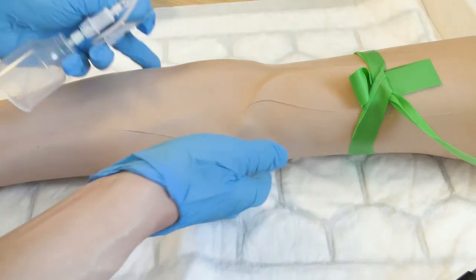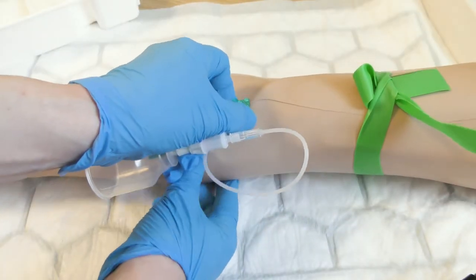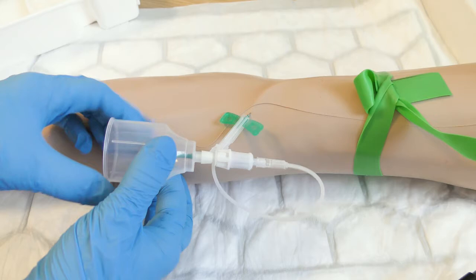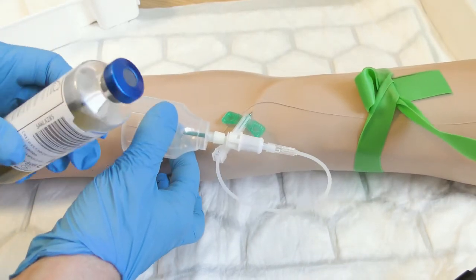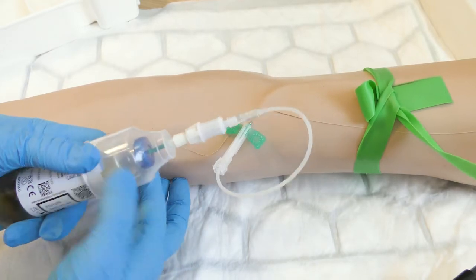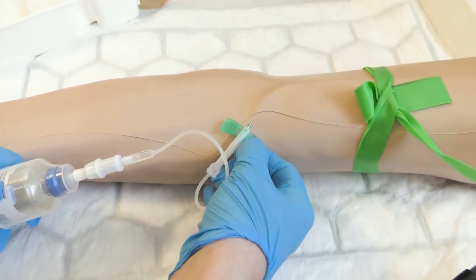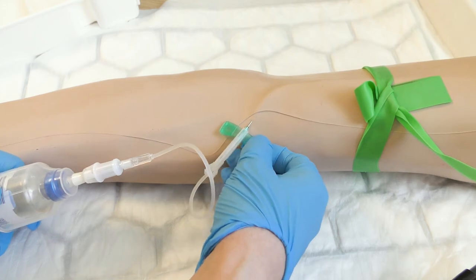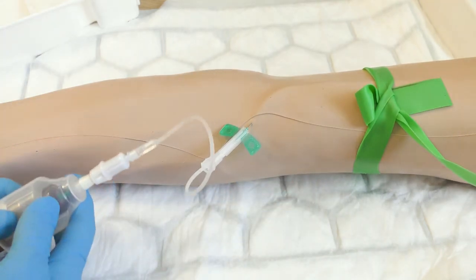Remove the protective cap and insert the needle into the vein. Take the blue aerobic culture bottle first and push into the cap. Follow this with the red anaerobic culture bottle.